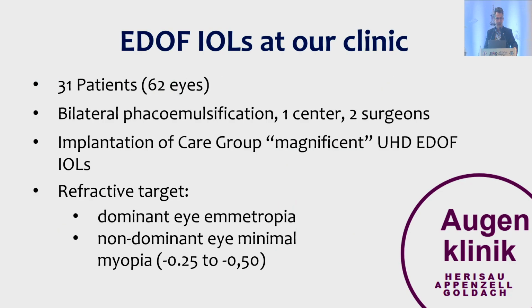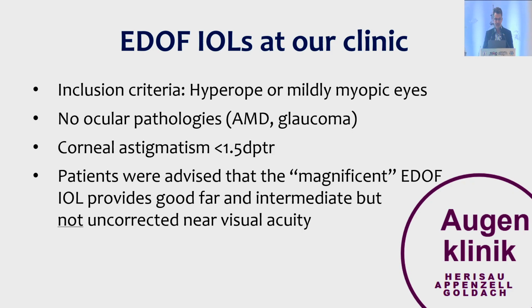So I just report a small group of patients, 31 patients, who had a bilateral phacoemulsification, 1 center, 2 surgeons, and we implanted the magnificent EDOF IOLs. And very important, the refractive target was emmetropia for the dominant eye and minimal myopia in the non-dominant eye.